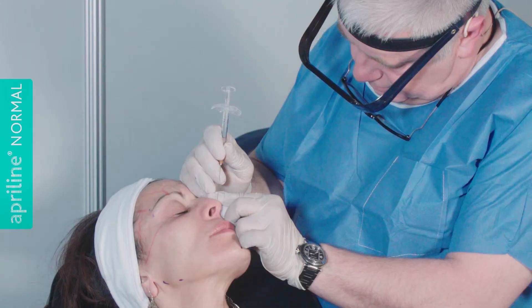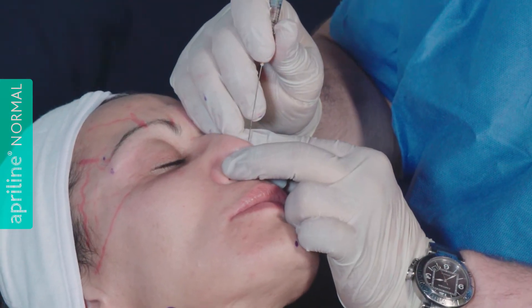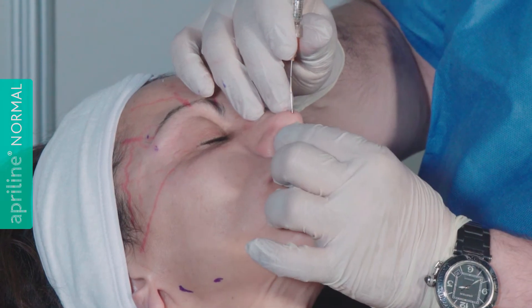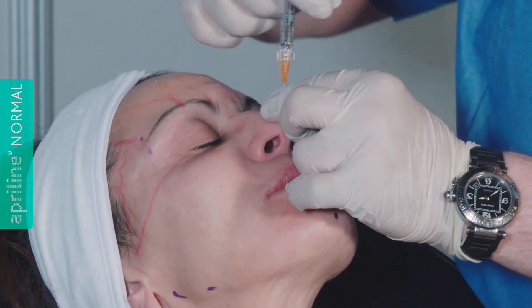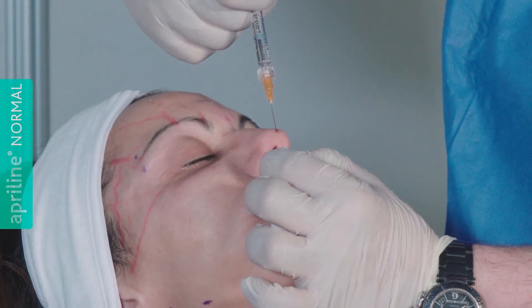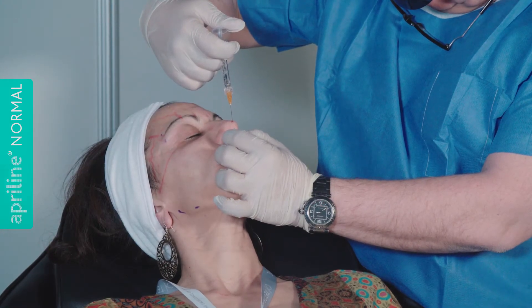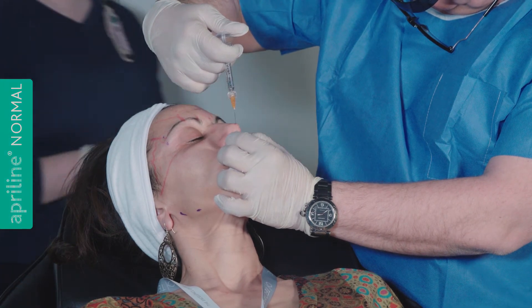So I make a little pre-hole just between the two dome cartilages. Then with your two other fingers you take the columellar area and introduce the cannula. I'm exactly on the nasal spine bone. When I inject, I pull the columellar area with my two fingers, and when I retire the cannula I inject the product — so there is no vascular risk. I inject this area to obtain a better profile. I will have a little elevation of the tip of the nose, a good support of the tip of the nose, and then a better position of the columellar area.